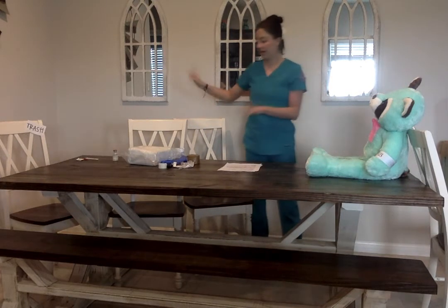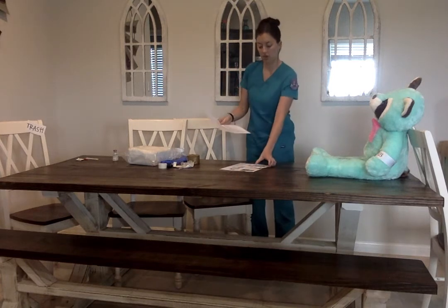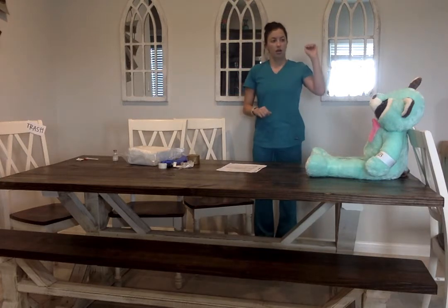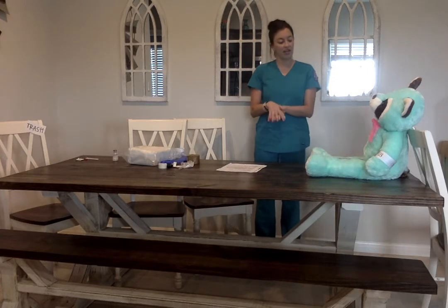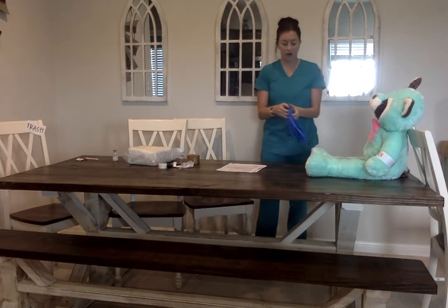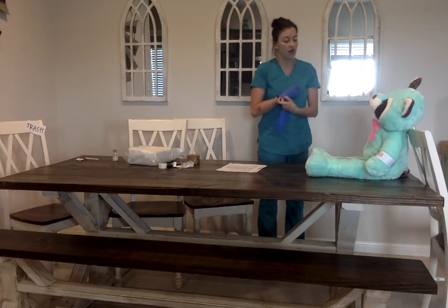Alrighty, I have gathered all my supplies. I have double checked my doctor's orders, and I'm going to enter the room. Knock, knock, knock. Closed door for privacy. Hand hygiene. Hi, Mr. Perez. My name is Taylor. I'm an ACC nursing student. I'm going to be giving you your medication today and inserting a foley cath for you.